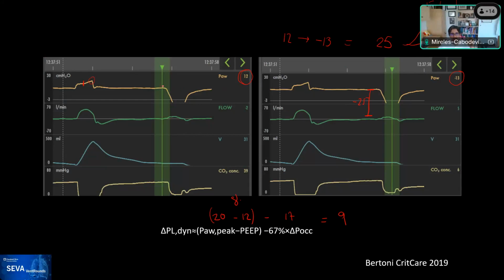So Karsten, we measured the airway pressure and it was 12, right? And so the delta in pressure went all the way to the nadir of minus 13. So the pressure dropped 25 from baseline total. So it went from a PEEP of 12 all the way to minus 13. That's where the 25 comes through. And that's a negative number, correct, Rob? Correct. Okay. Does that help, Karsten?